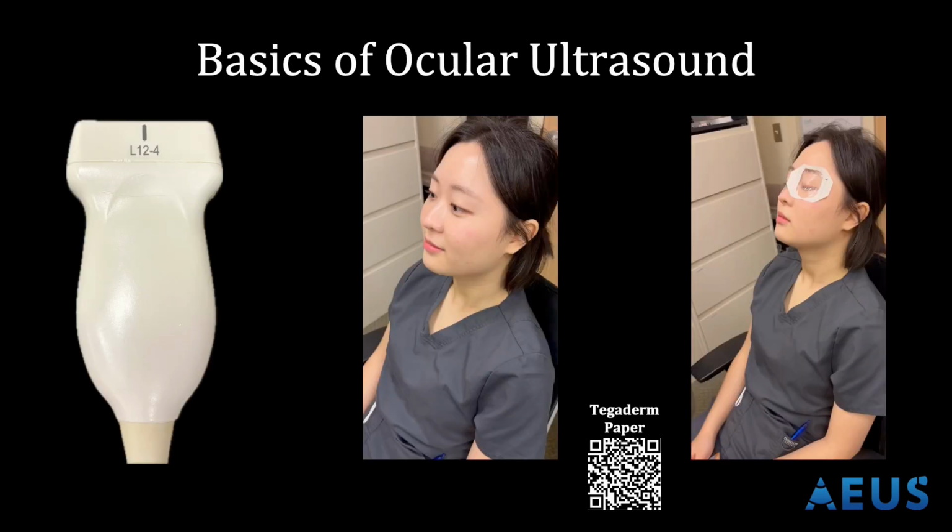Ocular ultrasound is typically performed with the high-frequency linear probe, as the eye is a superficial structure. The eye should be visualized in both high and low gain settings to ensure all potential pathologies are visualized. A Tegaderm may be used to cover the patient's eye, with a recent study showing better image quality without a Tegaderm, but decreased patient comfort, so that has to be weighed.